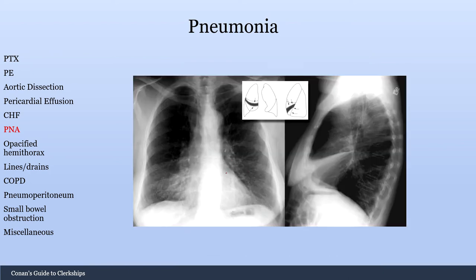One last example — there's a density on the frontal X-ray. On the lateral X-ray you can see a density here, which makes this a right middle lobe pneumonia, as illustrated by the different lobes.